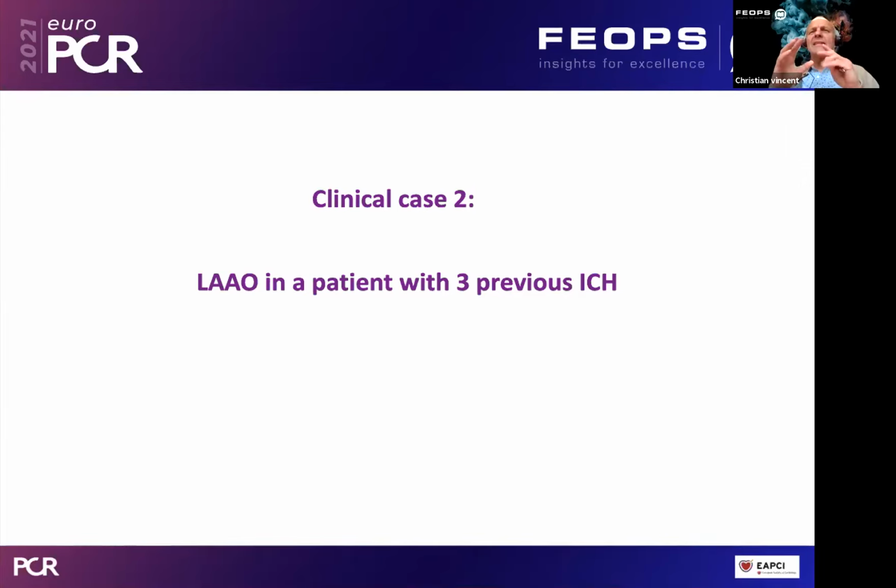In other words, LAA pressure can be different. The space around the anatomy, what we call the separation, can be different. And the question is mainly, is the simulation taking all those things into consideration for the intervention? In other words, how can we trust that the CT analysis is reflecting the real state of the heart at the moment of the operation?